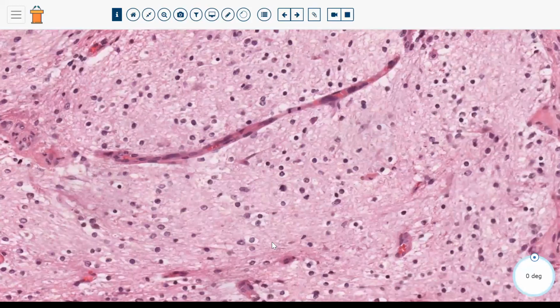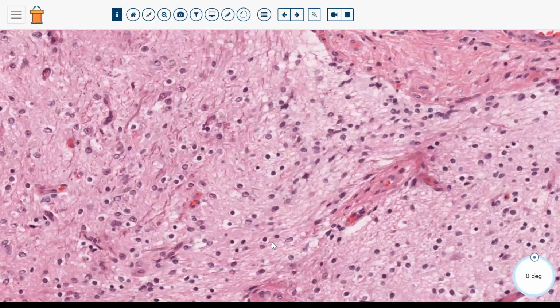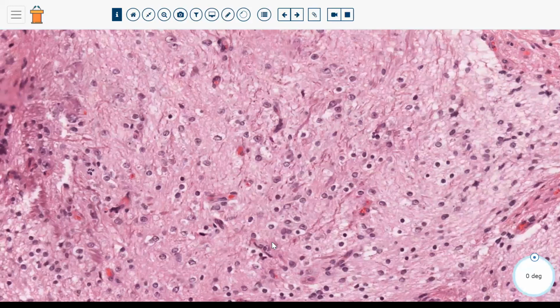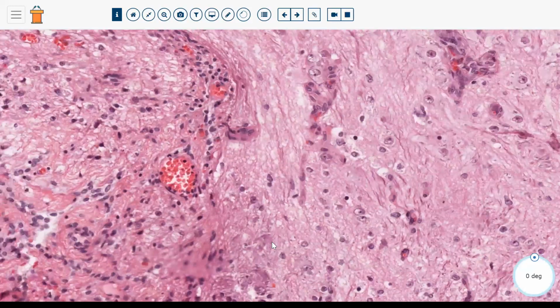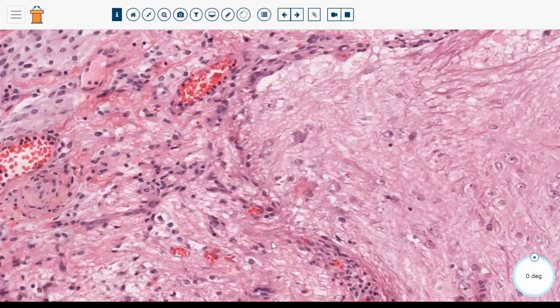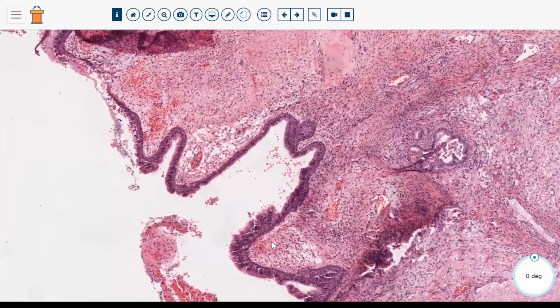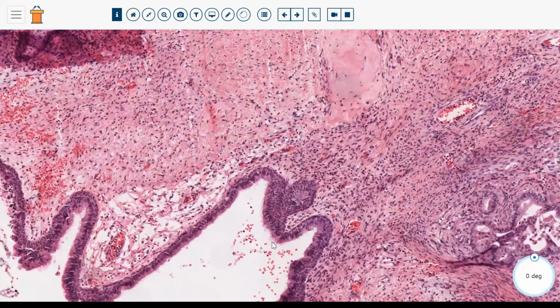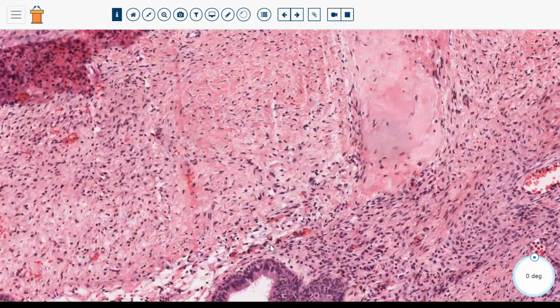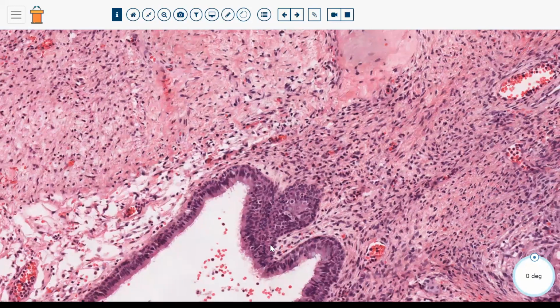To me, this is most likely glial tissue, so basically tissue resembling that of the brain, with glial cells and delicate fibrillary cytoplasmic processes. So this is glial tissue in a teratoma. Teratomas are quite interesting in that they can have all sorts of varied morphologies depending on what tissues they're recapitulating from any of the tissue types, the ectoderm, mesoderm, endoderm cell types.